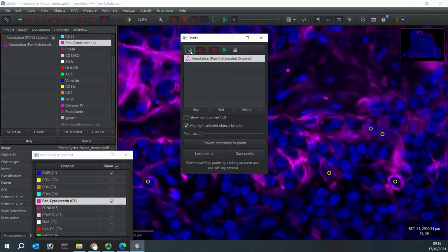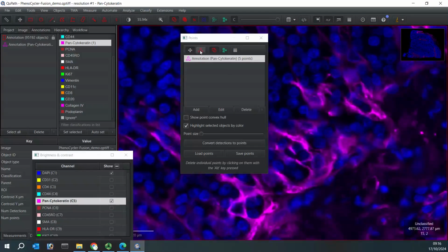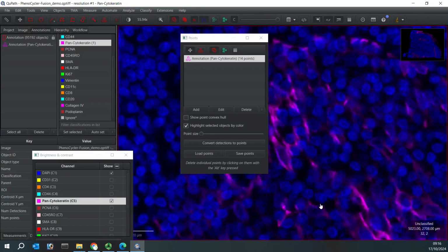Let's move to a different area. We can move to the top.